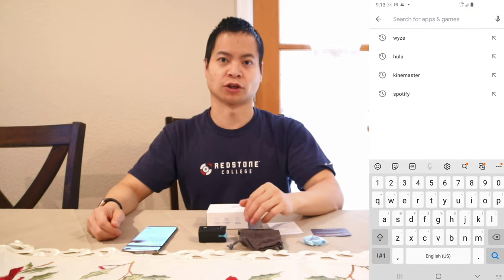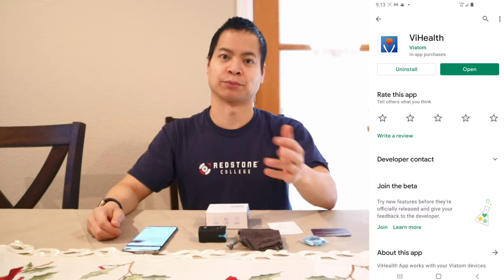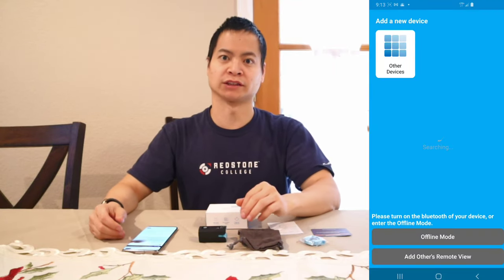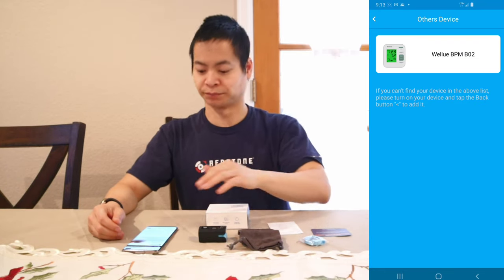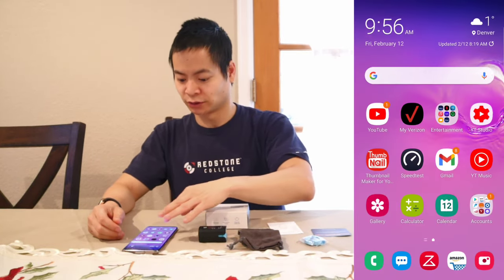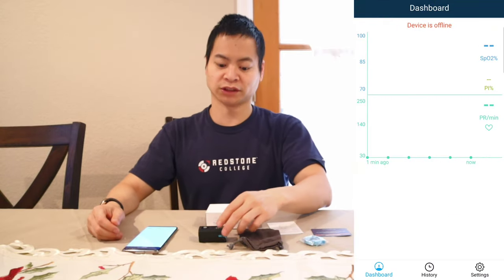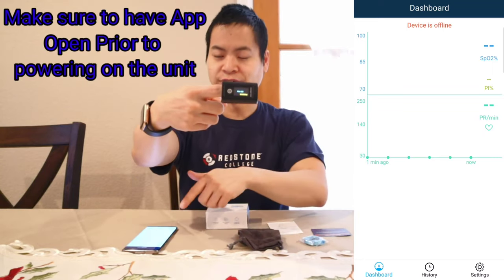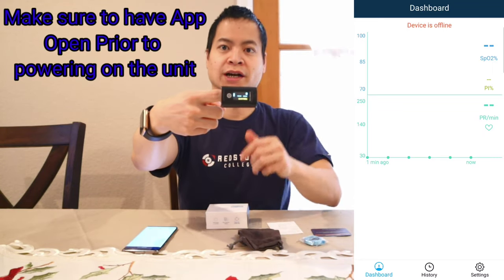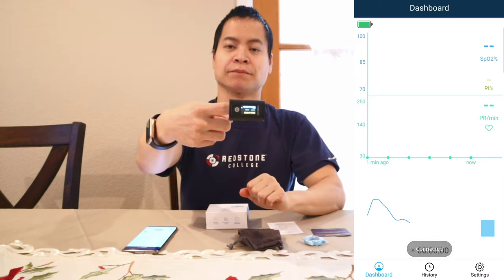The app is actually pretty simple to use. All you have to do is search VI Health in either the Google Play Store or the Apple App Store. There's no account login required — you just launch the app and once it's established with Bluetooth, it's ready to go. You can see that my dashboard is blank, but once I place the unit on the finger it will power up, and within a few seconds it's going to start showing my health reading — the SPO2 levels and also my heart rate.